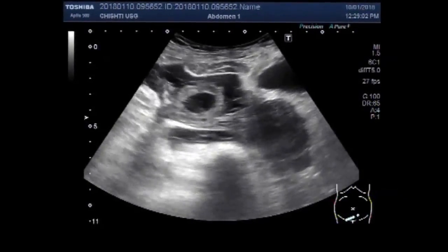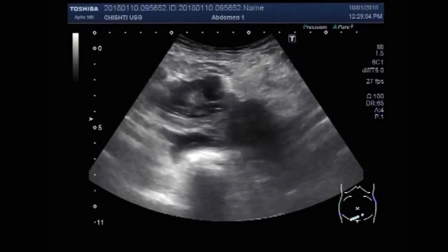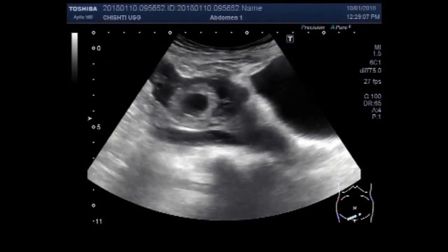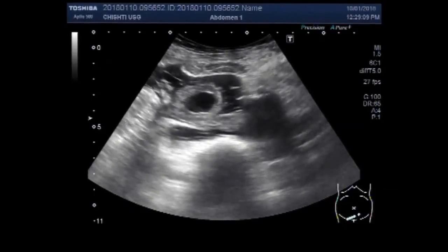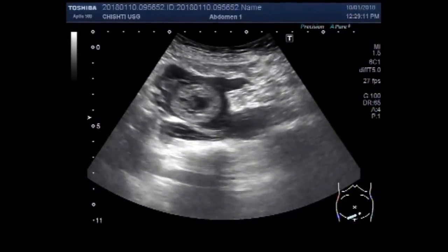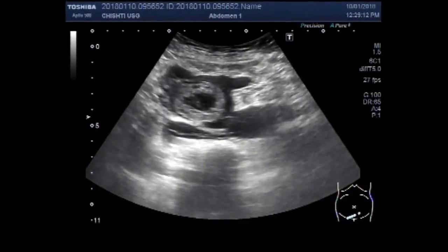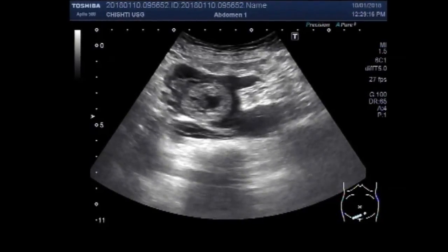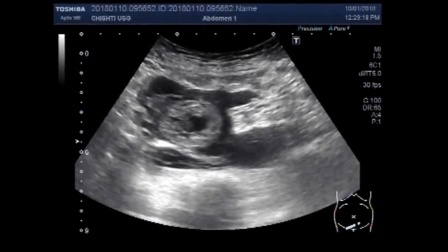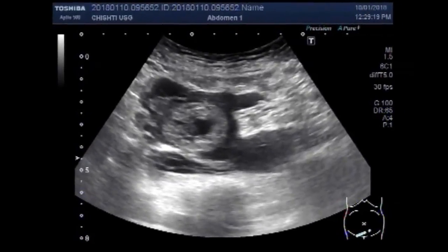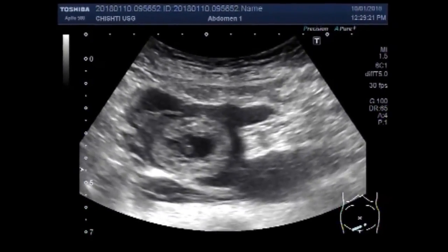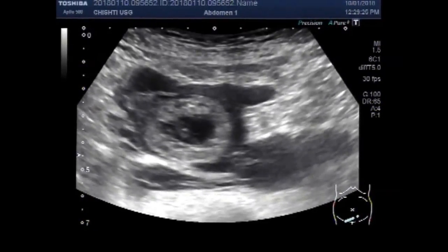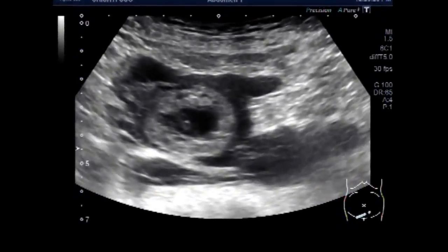Now this is a small gestational sac. A small umbilical vesicle is also seen along with the small dead embryo, having no blood flow in it and no cardiac activity visible.